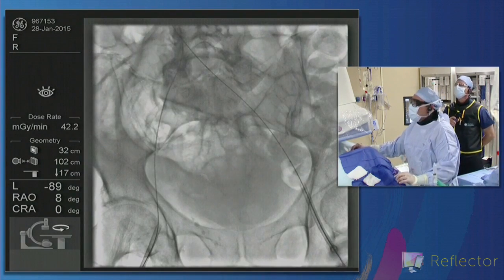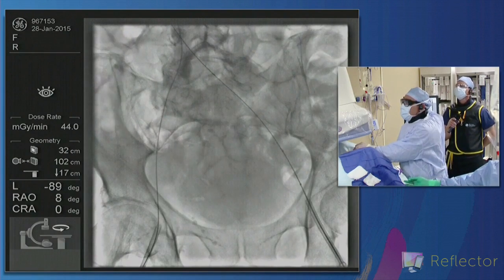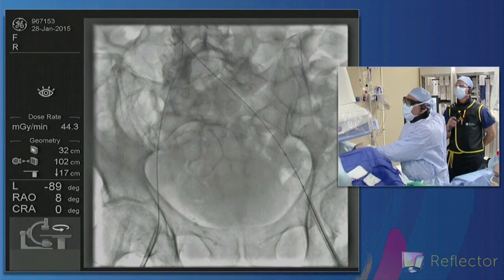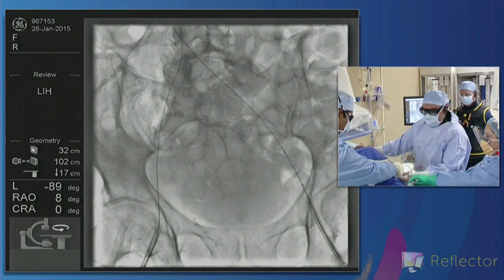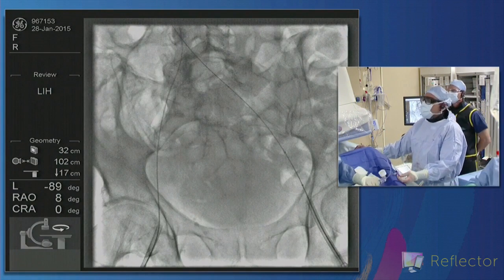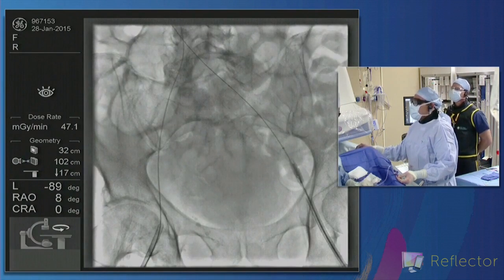I mean, that's pretty darn big. So we're passing the balloon now. With that kind of gradient, we'd be putting a balloon in. I mean, this has sort of convinced us in 3 different ways. There's been critical stenosis imaging, that's been physiologic. Yeah. There's been 3 different ways of confirming that this is there, plus the historical. These are dynamic compressions.